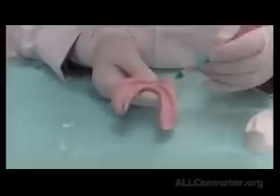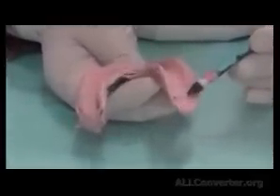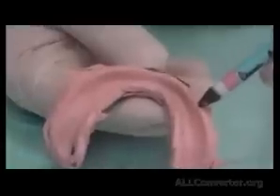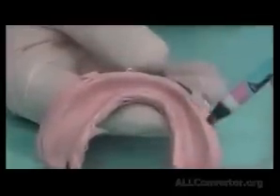To show you common mistakes that we might have with impressions that we have done, you might find the following problems. For example, here we have a good sulcus. Suddenly the sulcus discontinues. The material here has not been squeezed enough into place, or the material was deficient. If we go to this side, also this side, we have deficiency of impression material.